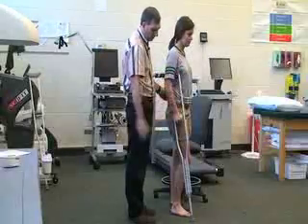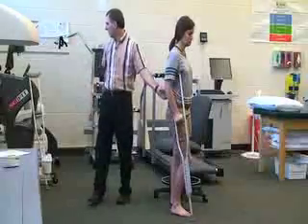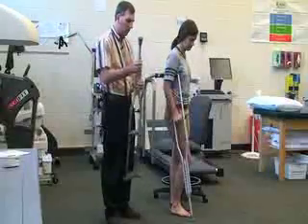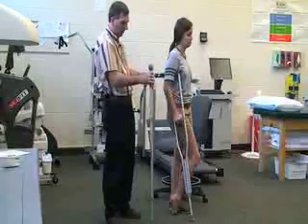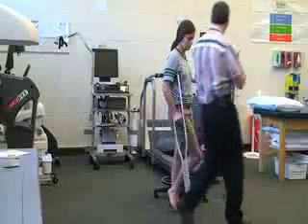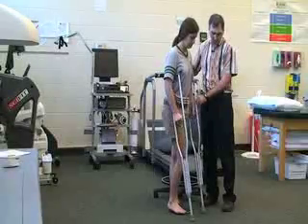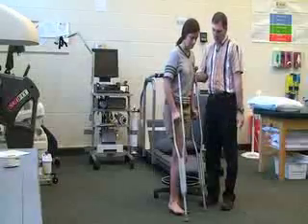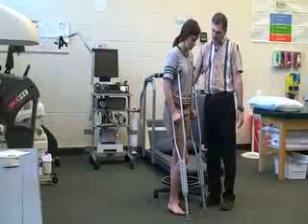Then I'm going to grab the other crutch and make quick adjustments to this one to make it the same height. For this one we also want to move it six inches up and six inches over. Again, check the elbow to make sure that it's bent at about 25 to 30 degrees, which it is.